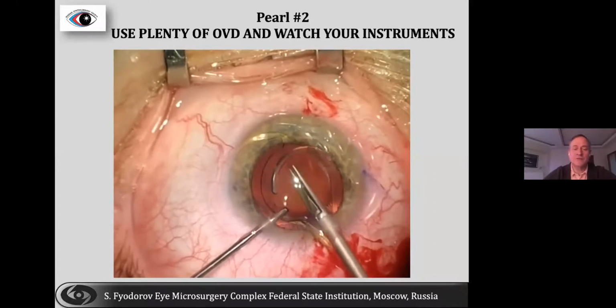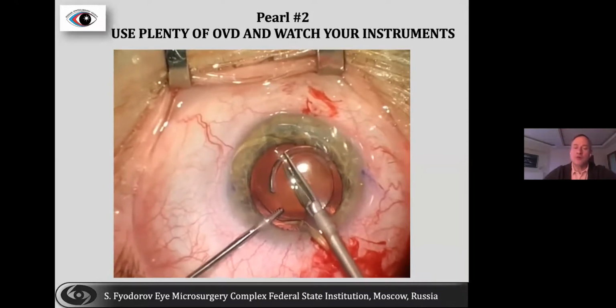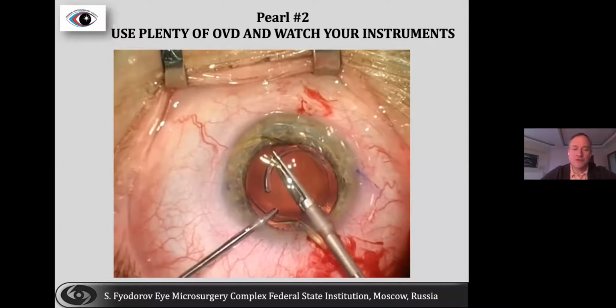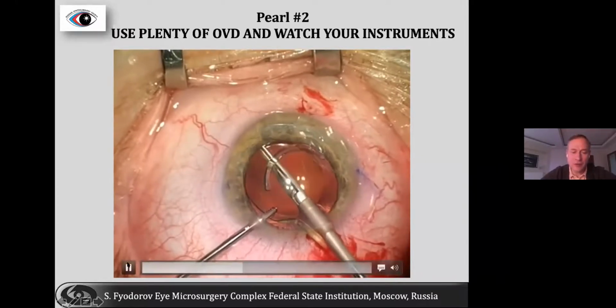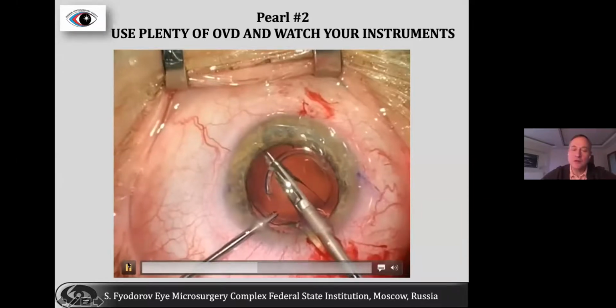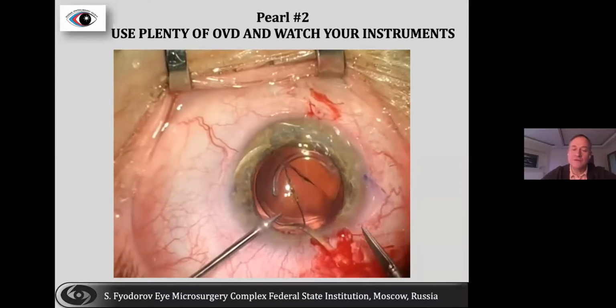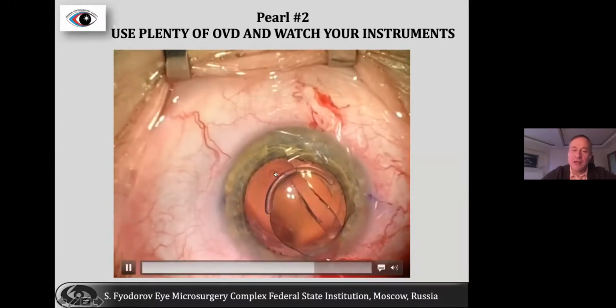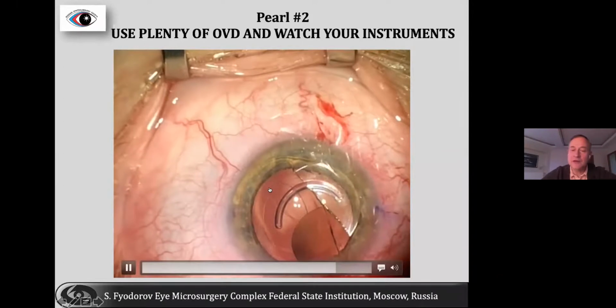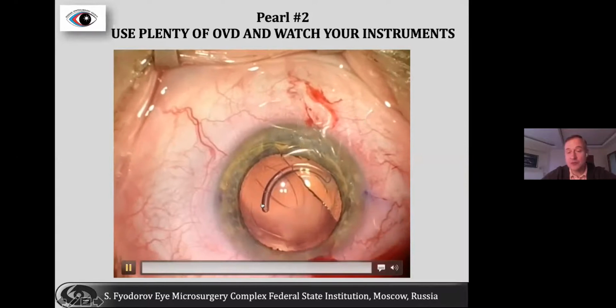This is an IOL exchange, because this toric IOL was not properly powered. So it was an exchange of one toric IOL for another toric IOL. But this is another sharp pointed scissors, and you have to be quite careful, as I will show you here, when you're cutting the final ends of the optics. You see here, I made a nick in the anterior capsule, and also I opened the posterior capsule with that instrument.